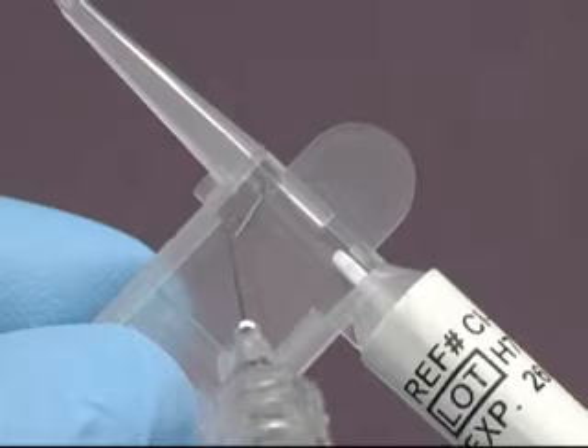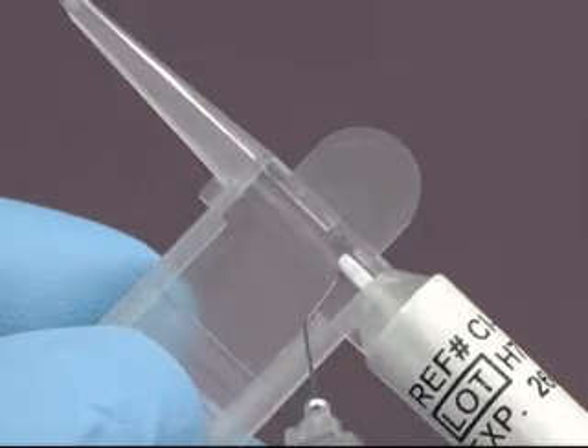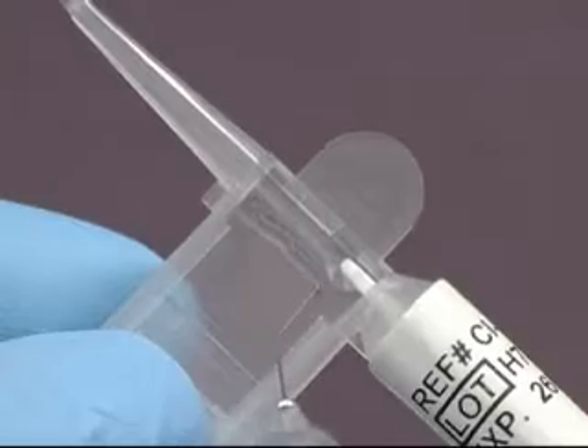While keeping the device level, apply Bausch & Lomb AmVisc Plus viscoelastic to the area extending under the lens track edge as well as the floor of the loading area as shown.